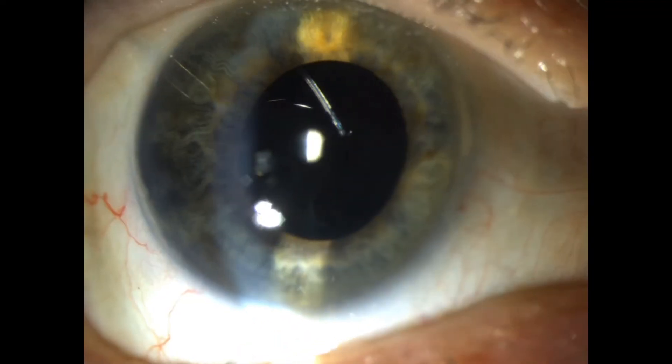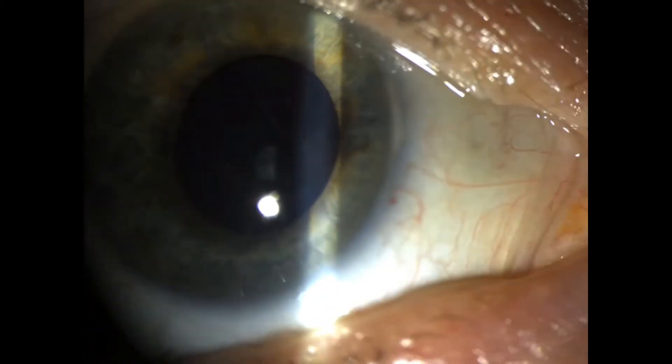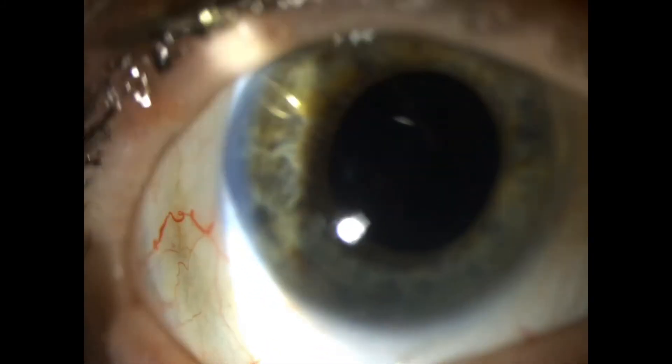You can tell that the lens implant is subluxed or dislocated over to the left and down. So not only does the patient's vision jiggle anytime they look left or right, but also the vision is out of focus. Just imagine having a permanent lens implant inside the eye that was crooked and not centered.